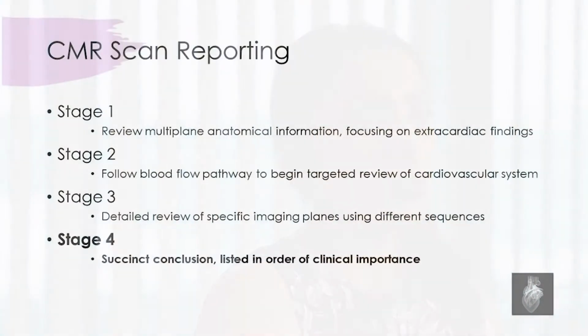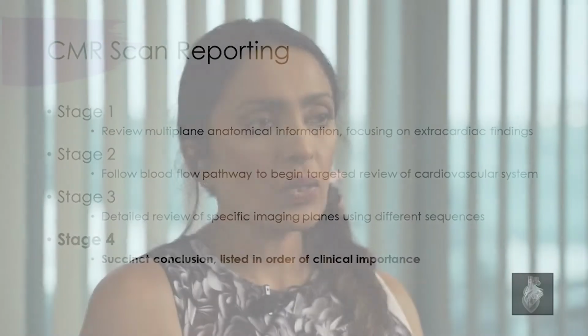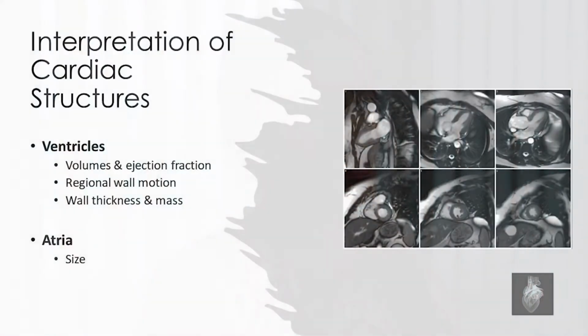Conclusions should be succinct and listed in descending order of clinical importance. A final unifying summary sentence may be required if you end up with a list longer than 5 or 6 at this stage. Referrers read this crucial conclusion section, not necessarily the entire structured report.